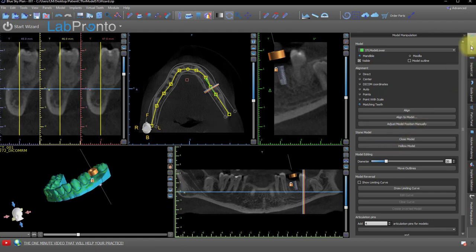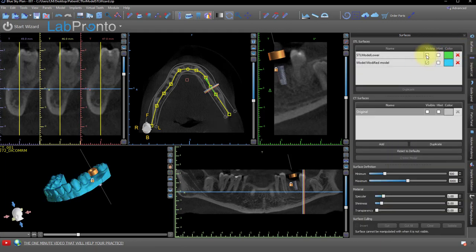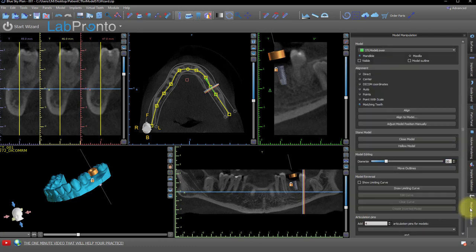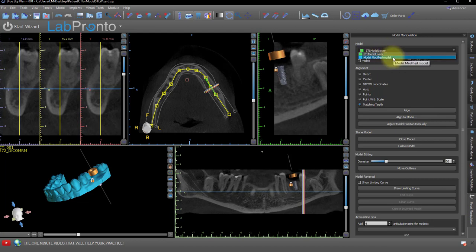In the Surfaces panel, hide the original model by unchecking the Visibility checkbox. Go back to Model Manipulation, and from the dropdown on the top, click the Modified Closed Model.